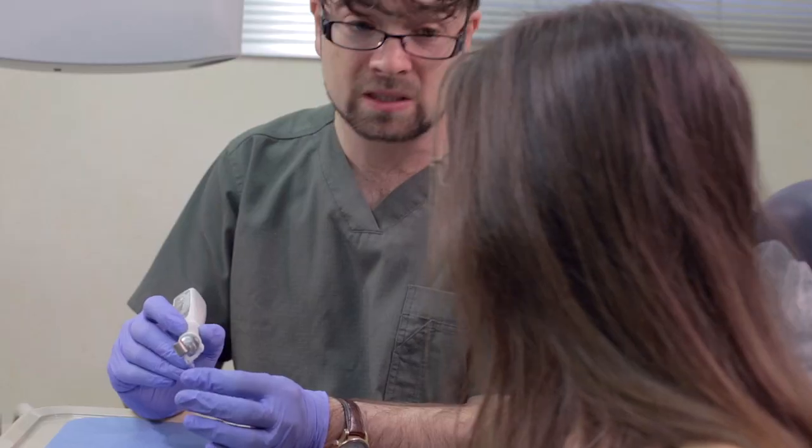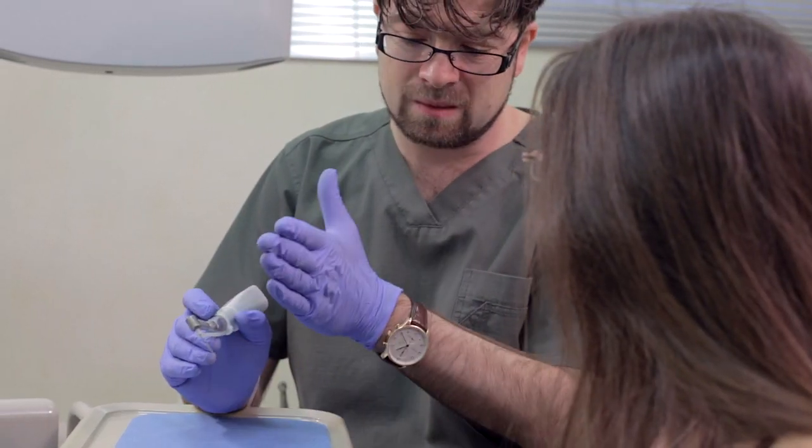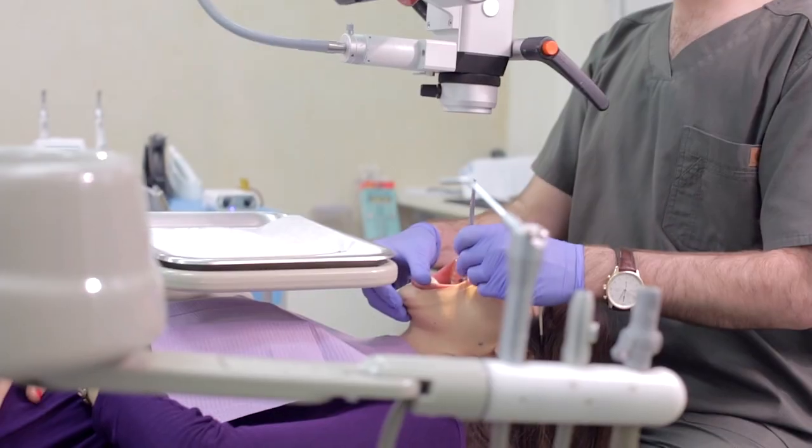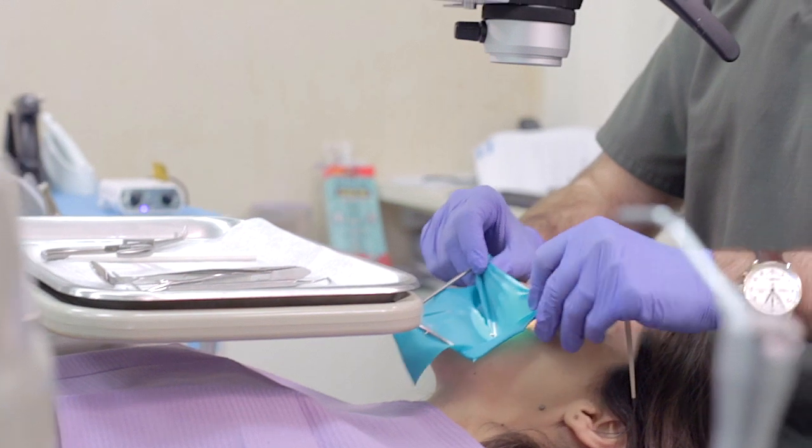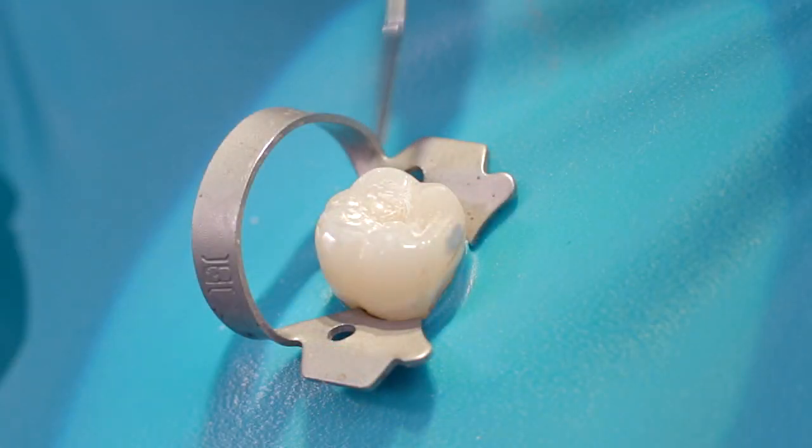To get used to this concept, adopt the system gradually into your clinical routine. Start from simple, more accessible teeth with straight canals, then move to molars. Isolate the tooth using a rubber dam.